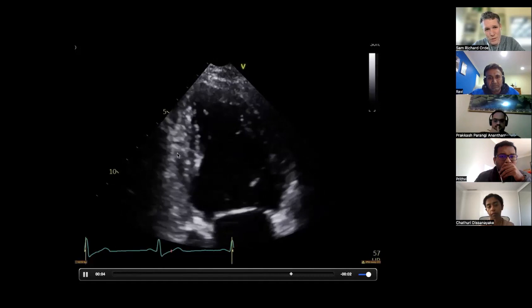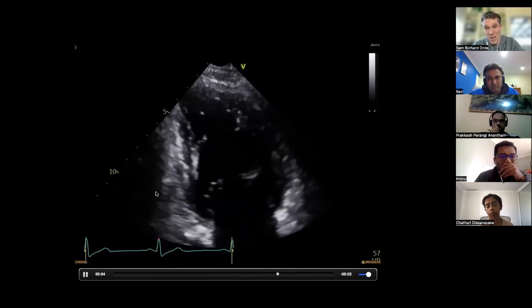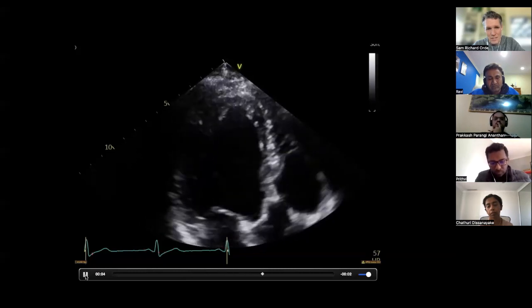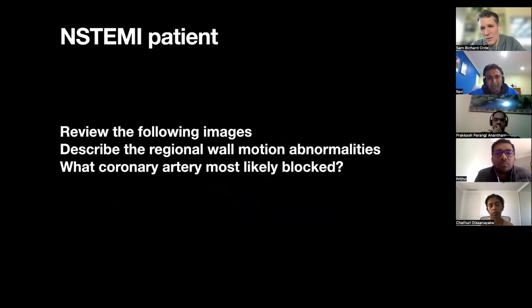But for me, I thought that the mid and the basal segments of the inferior wall here were hypokinetic. And the same here with the infraseptal, a second bite at the cherry of the infraseptal wall. So I guess it's probably a tricky case. It's not the one that's going to come up in the exam, probably, pass or fail, talking about which areas. What I was hoping that we'd be trying to see is the inferior area, inferior, infraseptal, infralateral, or hypokinetic. That RV looks mildly impaired.